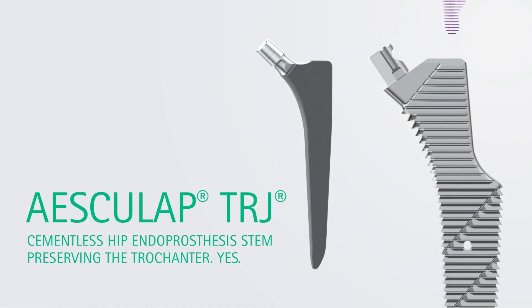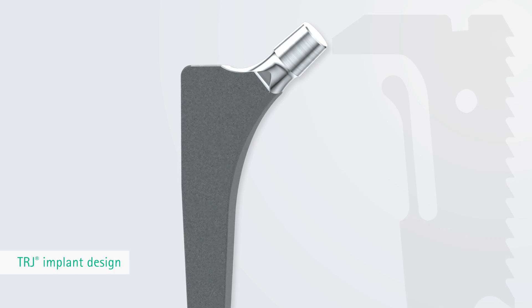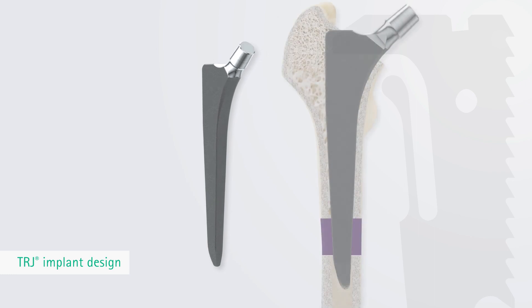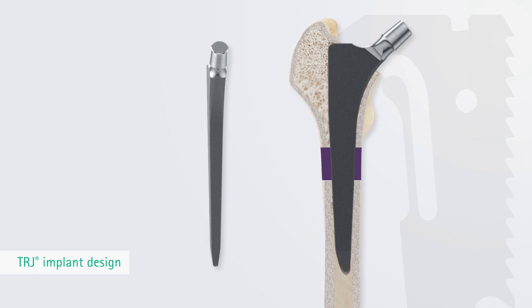Esculap TRJ Cementless Hip Endoprosthesis Stem. The TRJ hip prosthesis stem is implanted without cement. The stem design is based on many years of experience with a conical diaphyseal anchorage in the femur.